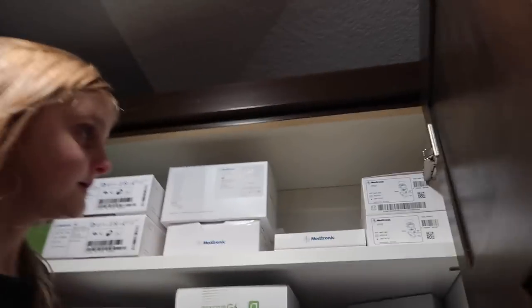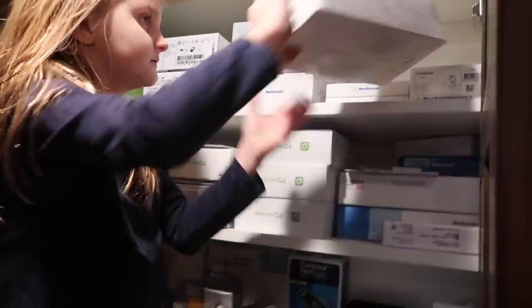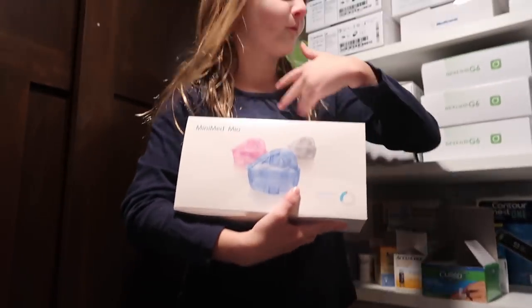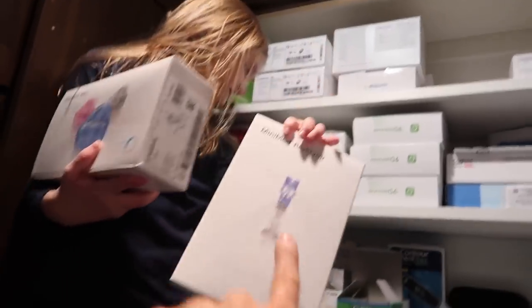So you can show them the boxes. This is from your Guardian pen — it's from your old pump. Those were what we used to give her shots with, if you see her old videos. And this is the stuff that you put the insulin into the pump. The pump's down there, we'll show you.